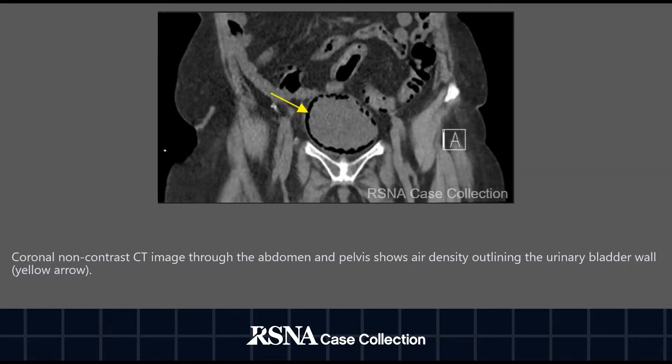This is a coronal non-contrast CT image through the abdomen and pelvis showing air density outlining the urinary bladder wall (yellow arrow).